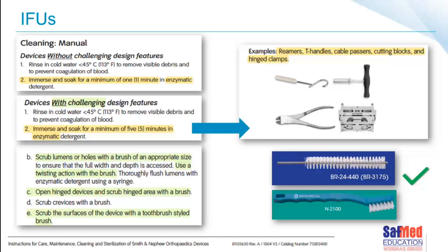But remember now, that then means for you to actually clean a device effectively, you need to follow their particular instructions for use. Now, the trick is, over the years, we've learned to clean things in a particular way. And then perhaps we move from one make or model of a device to another, and we make an assumption that we can just clean them all the same. But that's not true, because you really and truly have to follow those instructions for use.